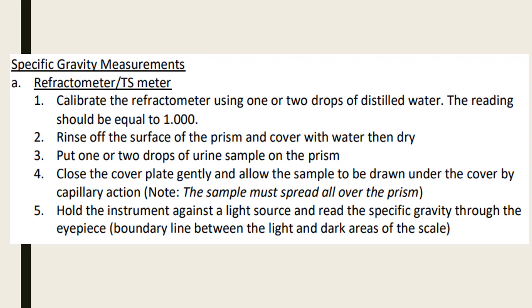Let's take a look first at your refractometer or your total solids meter. It is the one that is recommended by CLSI, and it is calibrated. In doing so, you calibrate the refractometer using 1 or 2 drops of distilled water. The reading should be equal to 1.000.